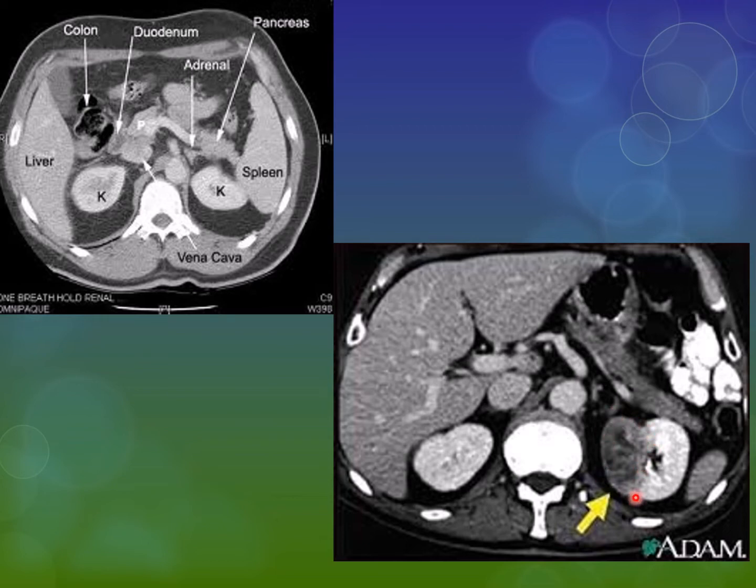And as you can see, that tumor is roughly the same size as that kidney. That's one of the bad parts about kidney tumors and kidney cancer. It is so well concealed that usually by the time we find it, they're pretty good sized, okay? So this here would be a renal tumor.